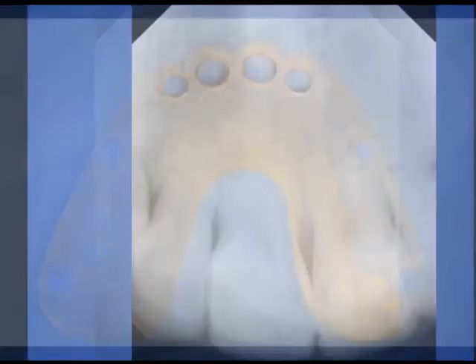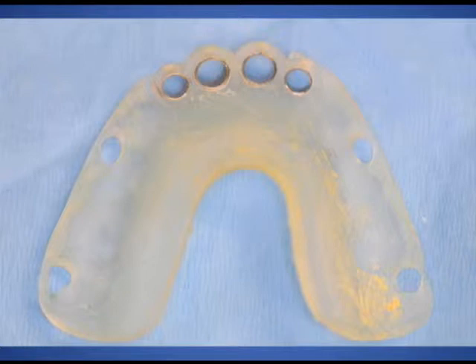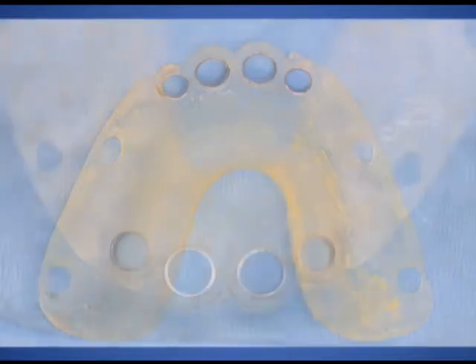But first and foremost, we had to design a surgical guide that would allow us to correctly place the Nobel BioCare replace select dental implants in a relatively tight area.